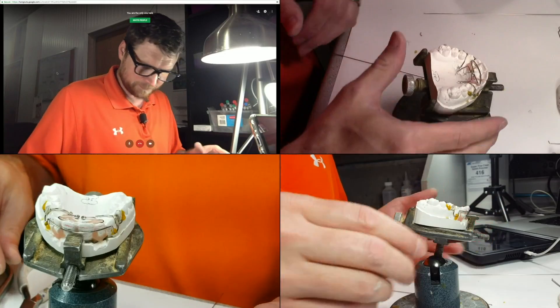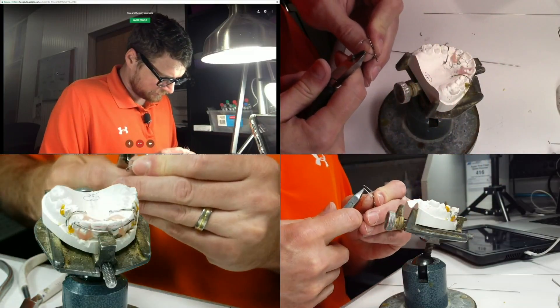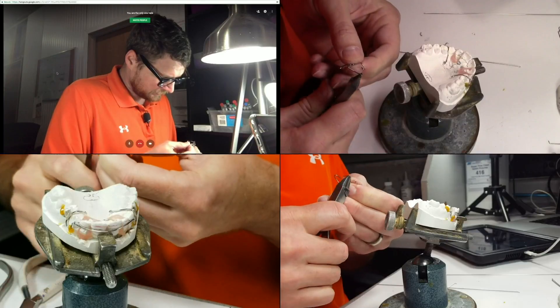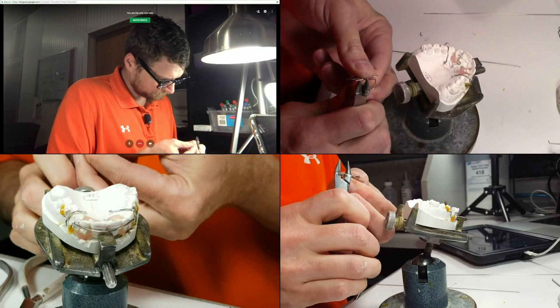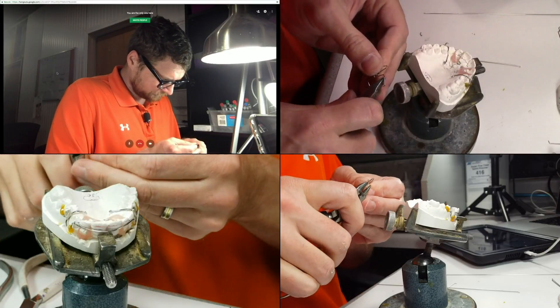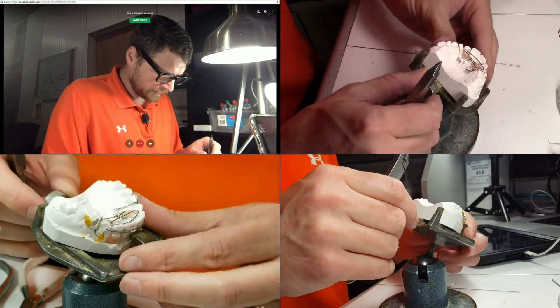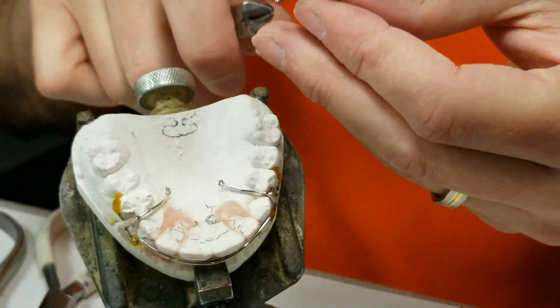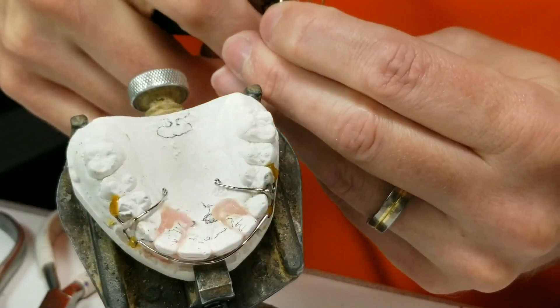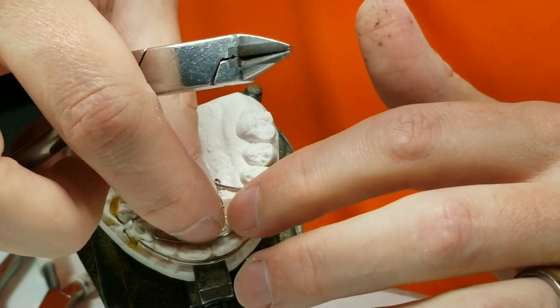Alright, I think everything is pretty much set. I just need to make my little loops — my little acrylic tags. I like to just bend these in like this. I need to taper those more toward the gingival, so I'm just going to torque them — torque, and torque — and we are good.